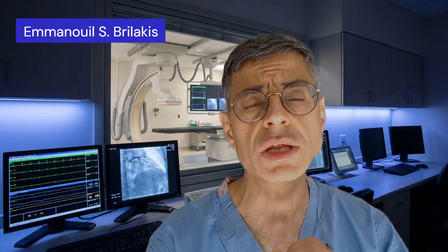Thanks, Yader, and great introduction. As you said, post-PCI FFR or physiology is something we don't typically do, because we believe that most of the time we have a good result, and often we do intravascular imaging, so we're fairly confident in our results. But unfortunately, many patients don't feel the best after PCI, and in some of them it might be because they have diffuse disease or for other reasons, but in many patients the reason may be that the PCI we did wasn't the best possible result.